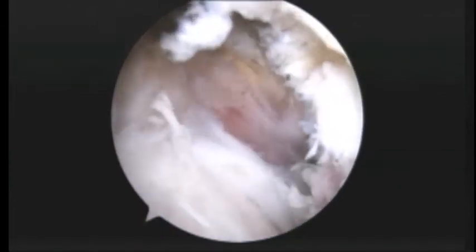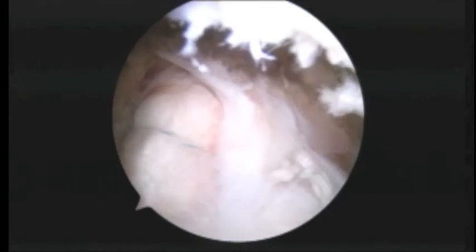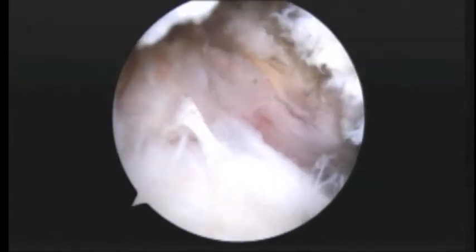Okay, so we've got the sutures tied for the biceps. That's that white stitch right there. And everything moves together as a unit. We've got our rotator cuff repaired. We've got our biceps tacked down. So we're going to finish up and get you back to the recovery room shortly.